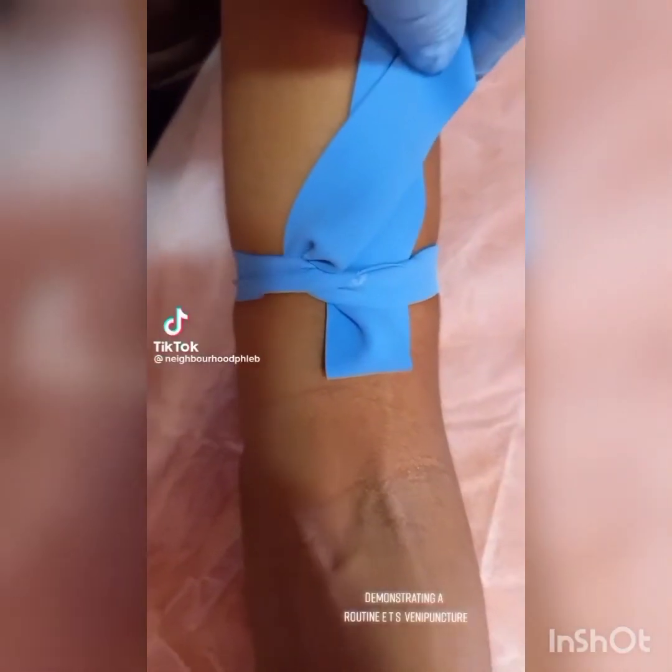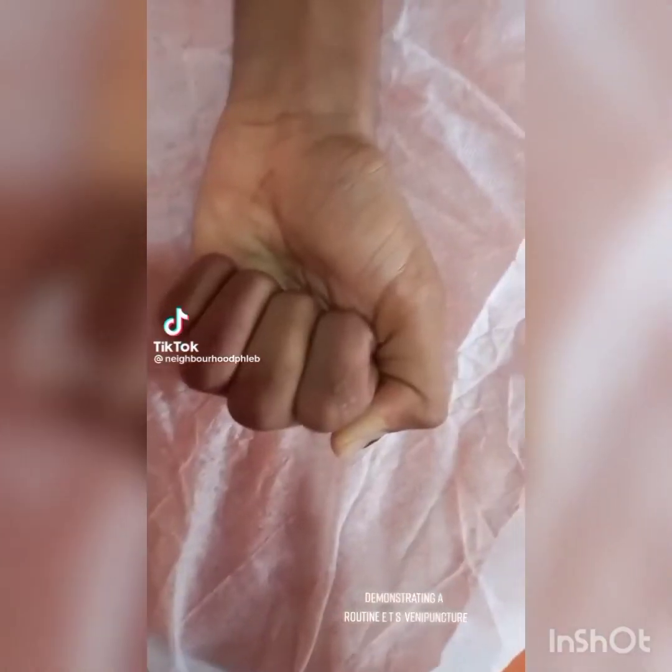Then after that, we place the gauze, remove the needle, activate the safety feature, and apply pressure. Then we discard the collection unit, we label tubes, observe special handling instructions, check the patient, and apply a bandage. Dispose of used and contaminated materials, and then we thank the patient, remove gloves, and sanitize our hands. And lastly, we transport the specimen to the lab for further testing. So this is what the ETS looks like. Demonstrating a routine ETS venipuncture.